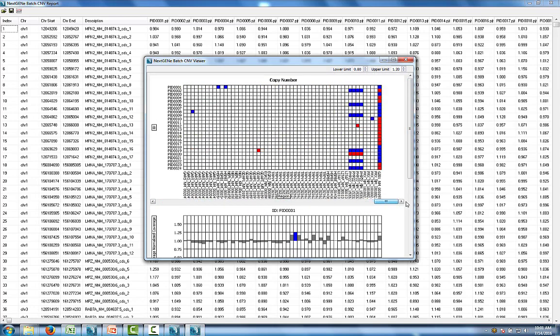And if we scroll over here, we can see we had one region that was on chromosome X, so we have a sort of measurement identifying samples by gender. And we also have some validated copy number changes in this PMP22 gene in a few of the samples.